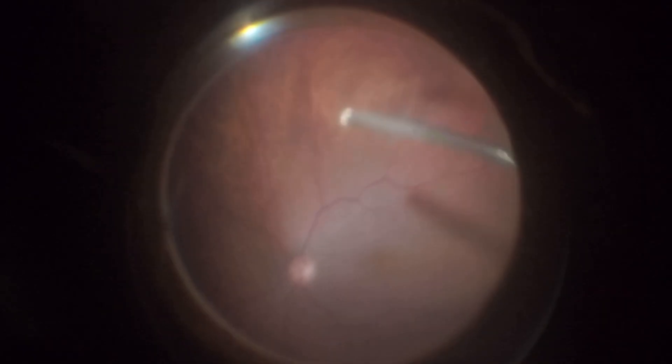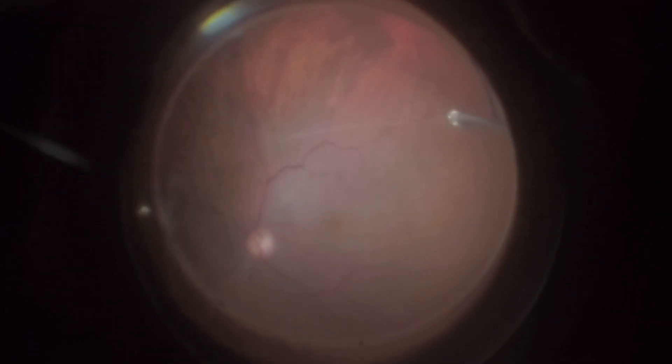The procedure begins with a core vitrectomy followed by induction of posterior hyaloid detachment. Since the patient is relatively young and has an idiopathic macular hole, it is essential to perform this maneuver slowly and in a controlled manner, anticipating potential areas of vitreomacular adhesion in the periphery to avoid iatrogenic retinal breaks.